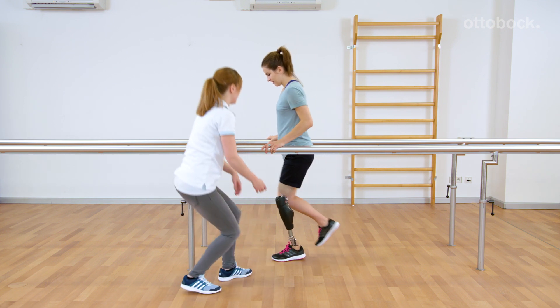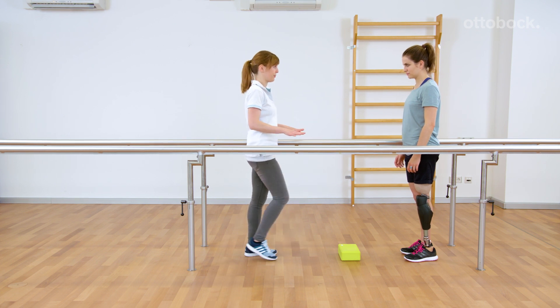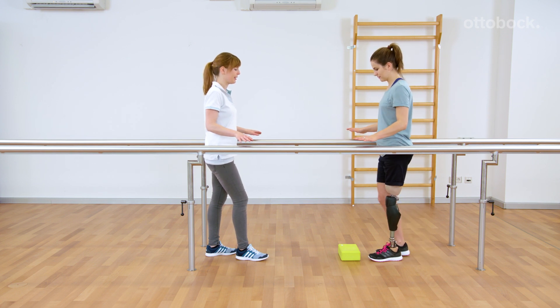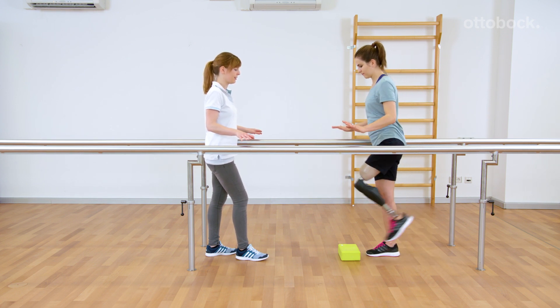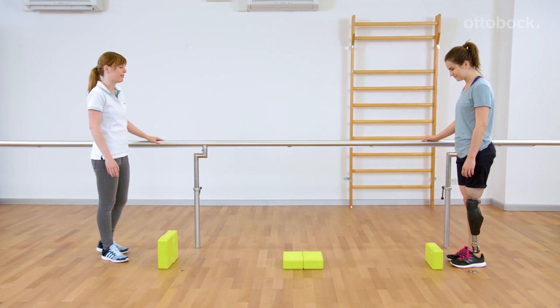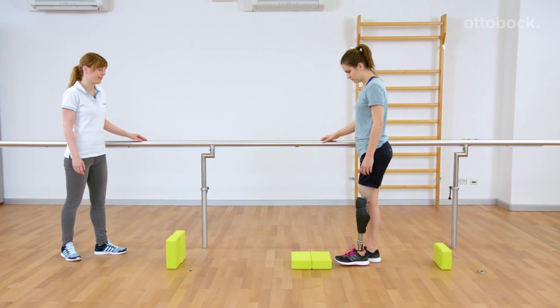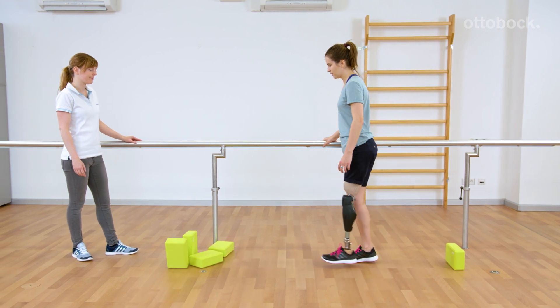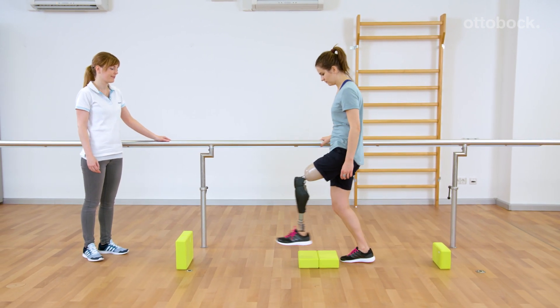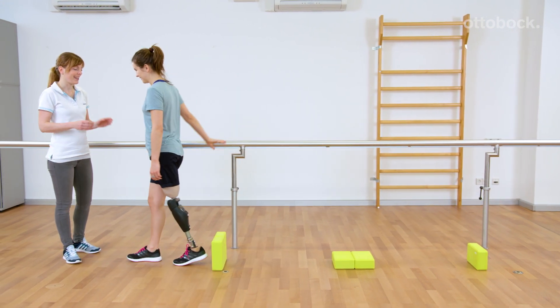Begin with a small obstacle and let the user try to step over it without using the handrails, but take care that the user's hands are close to the handrails. A few obstacles can be placed in a line, and the distance and height of the obstacles can vary. Soft obstacles should be used since accidental kicks can easily happen during training. The technique can be trained until the motion for triggering the function becomes subtle.